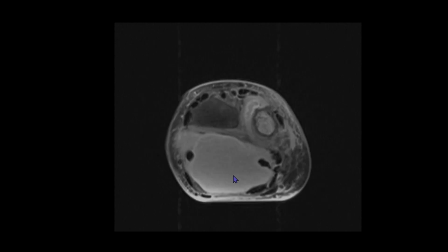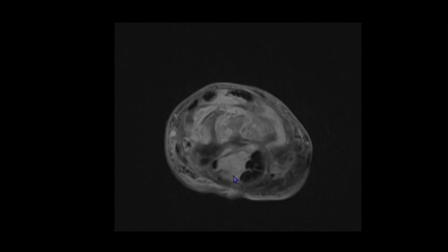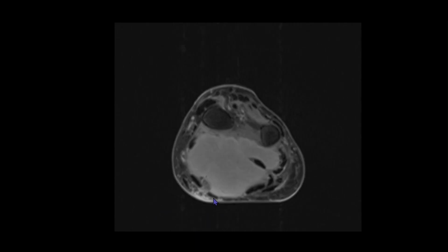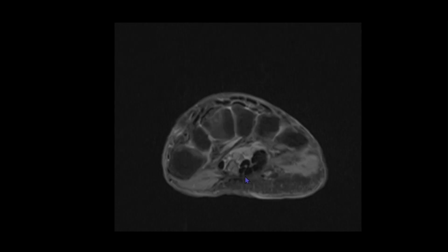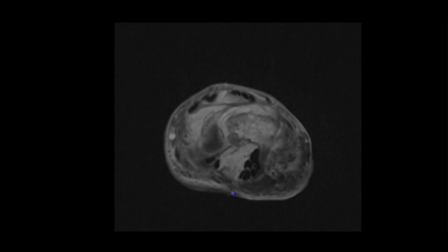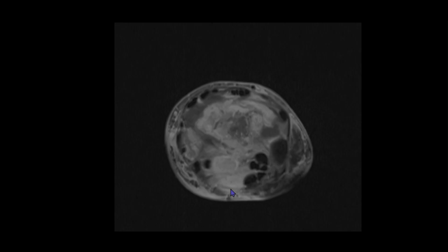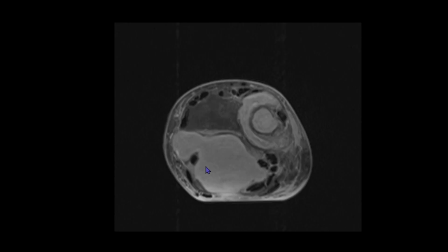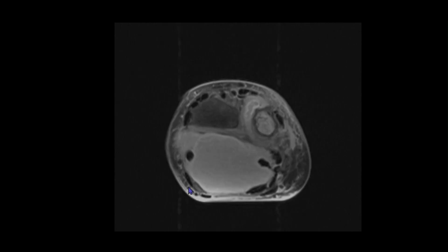Here we see that on the volar aspect, two nerves would be seen which are crossing. On the volar aspect, the main nerve that we see usually is the median nerve. So here is the median nerve, and as we trace it proximally in the forearm, we see that it is severely displaced by the collection, and it appears to be flattened in this region.